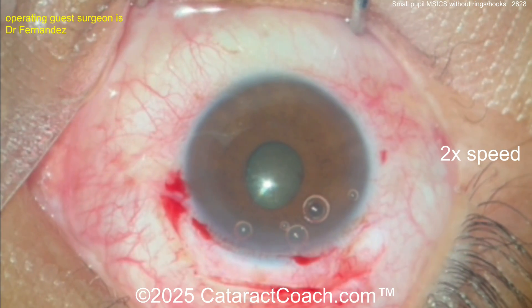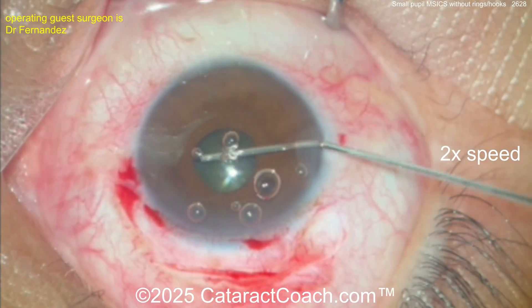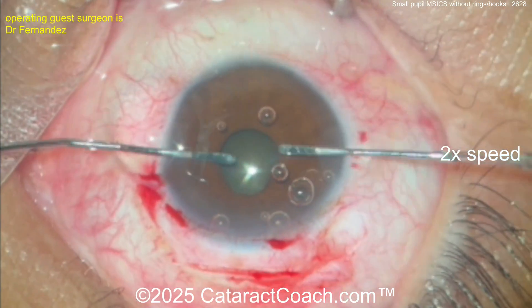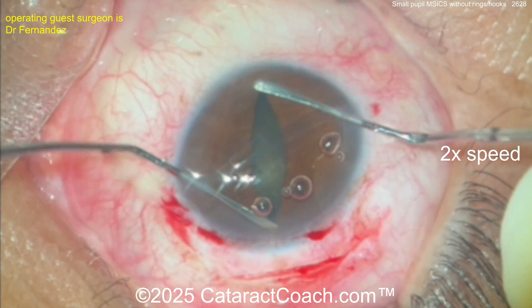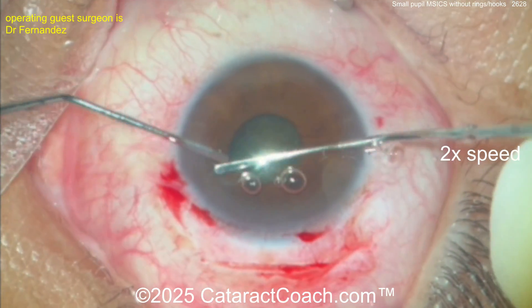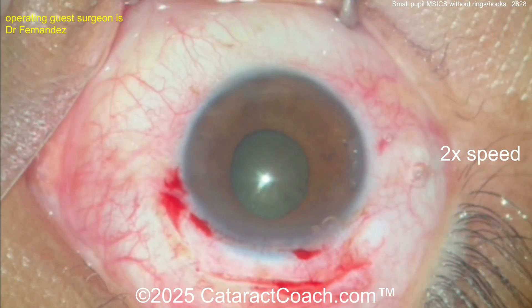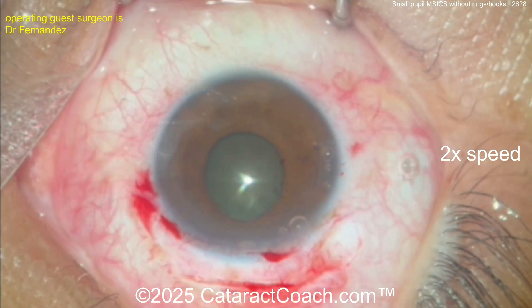Remember you need to get a good five millimeter or larger capsular rhexis. You can sometimes use some pharmacologic agents — maybe put in some epinephrine or phenylephrine — or you can just do a pupil stretch like this: two hooks and just stretching out that pupil. This will cause some micro sphincter tears at the pupil margin. You can then put more viscoelastic in — Osher's technique of viscomydriasis.